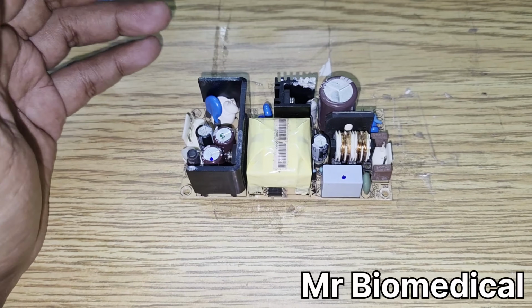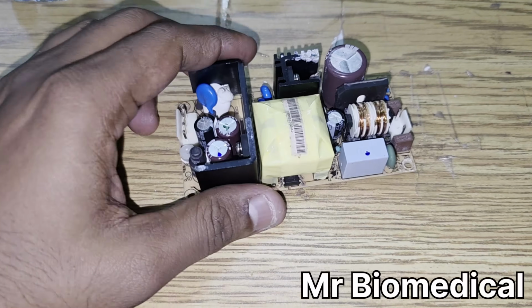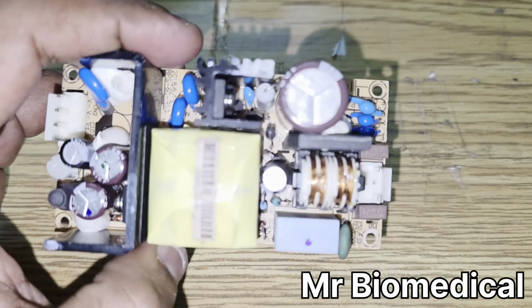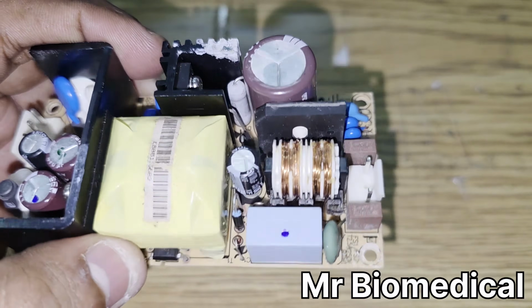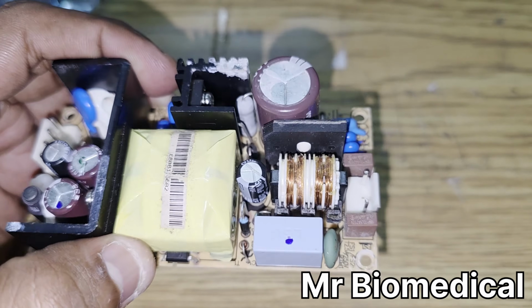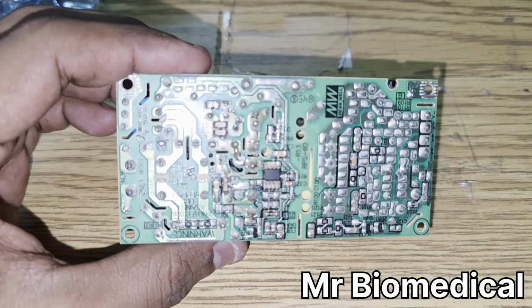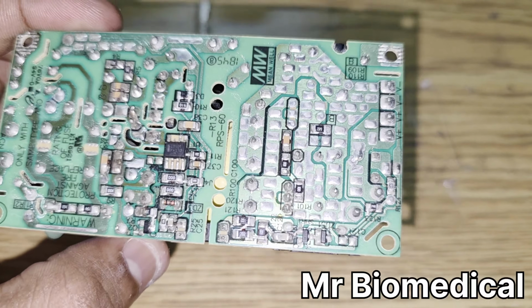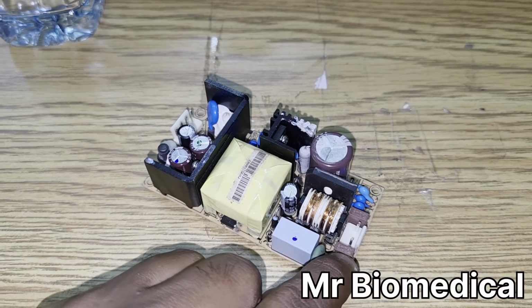Basically, whenever you are going to repair a power supply board, SMPS or whatever it is, we have to visually inspect first. In this case, I'm showing you that the fuse we have to check with a multimeter. There is no crack in the components, there is no bulge in the capacitors, and there's no cold joint or anything. So we have to test it with the multimeter.